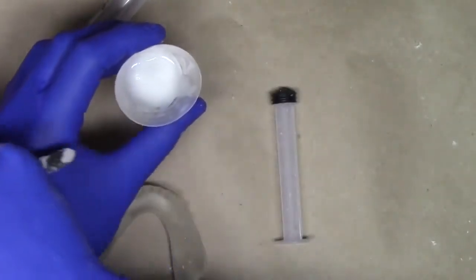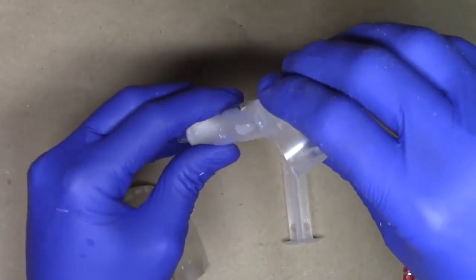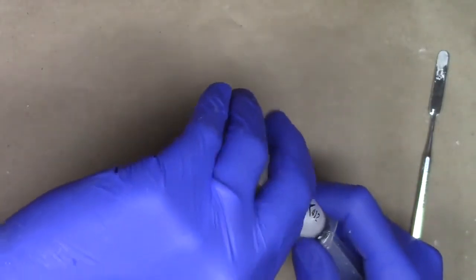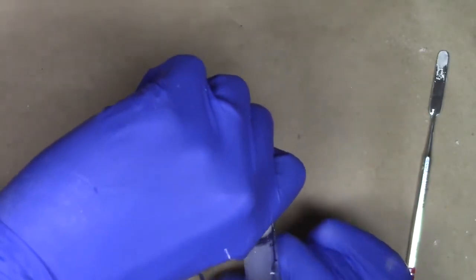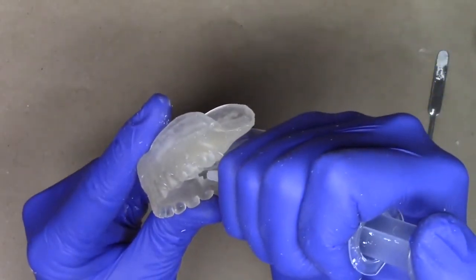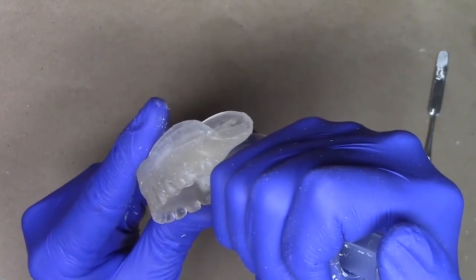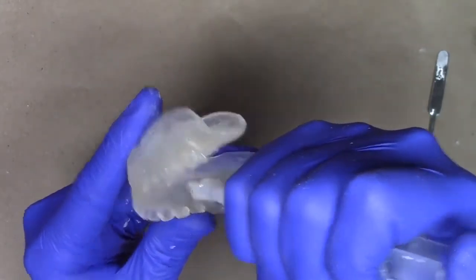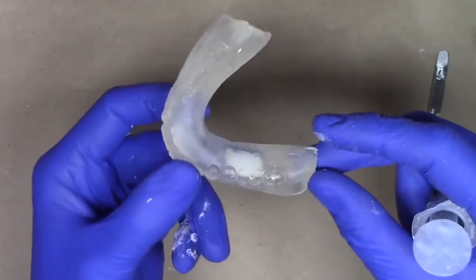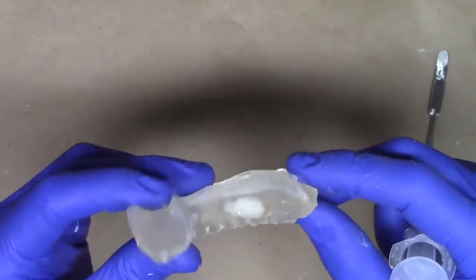Make sure it's nice and runny. And similar technique, I just pour it in. Fill my Monoject syringe, being careful to watch eyes as well as walls. Okay, and I'm just going to fill in a couple of these little voids just like so. Doesn't need to be perfect. This is just to fill in a couple of these structural voids, so that way you can have a very nice looking surgical guide. While not critical, this is more or less for those perfectionists out there.